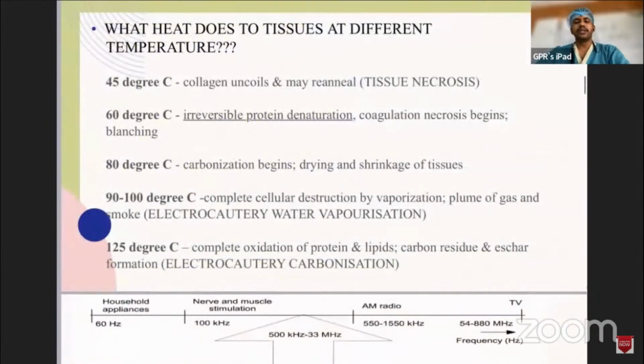So the dermatologists or dermatosurgery people use fulguration and other techniques to remove warts, sometimes to remove a corn. Sometimes they directly use the electrocautery machine, which uses alternating current directly on the patient's tissue, rather than using a cautery machine which converts the alternating current into a radio frequency current, which is then transmitted to the electrode, which then causes the desired effect.